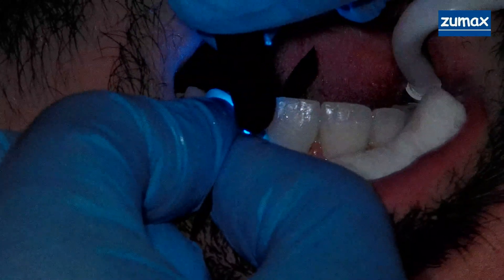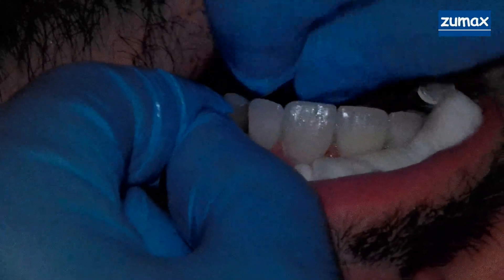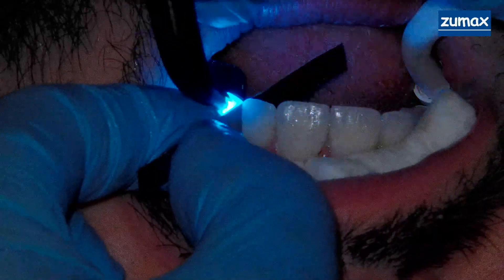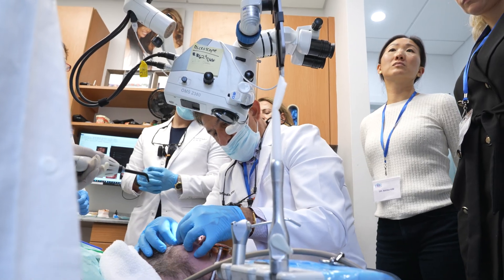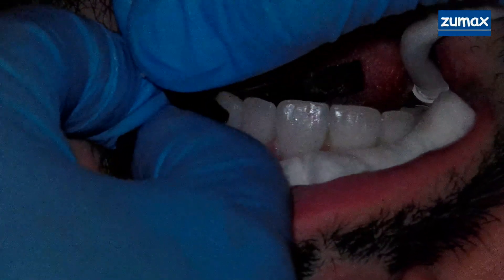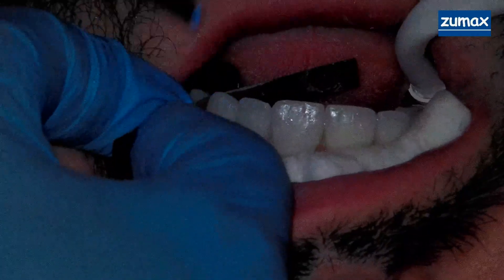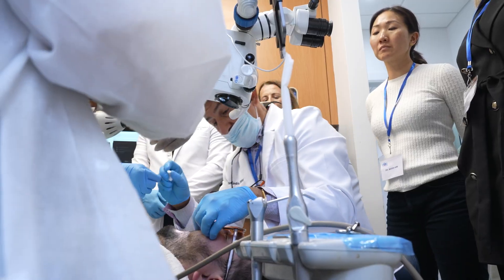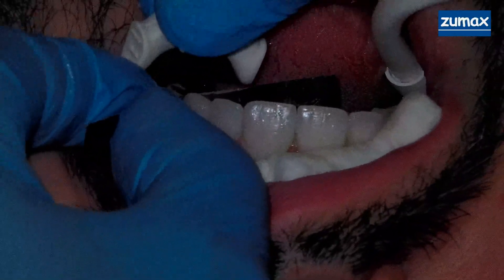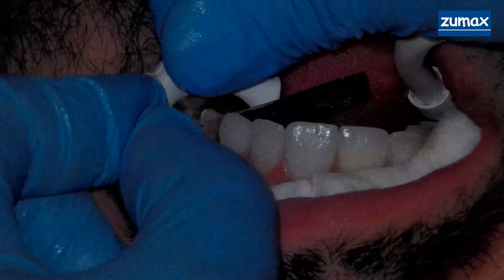Tack. Next two — out from the lingual. Tack and go. The last one is a distal here — it's a little tight, I push it in. And now I need a quick strip. I leave that one in on the premolar and quick strip the distal. Slowly open. I really got a tight contact here so I got to push it.